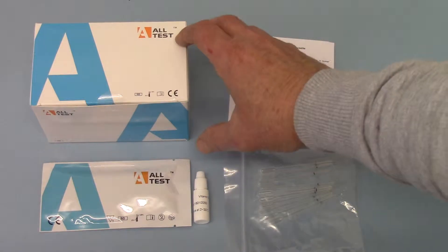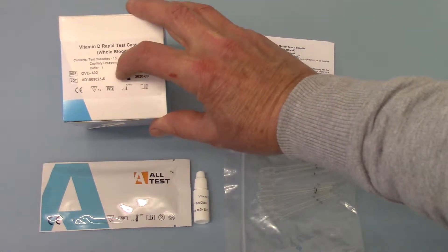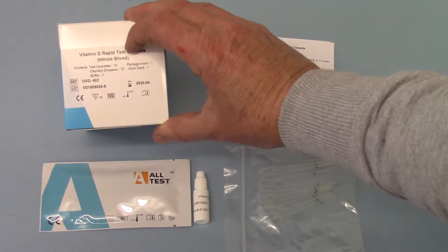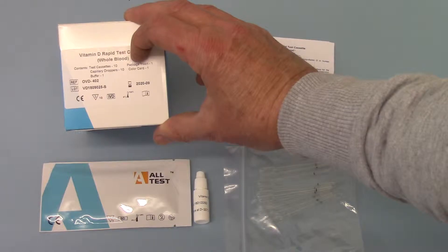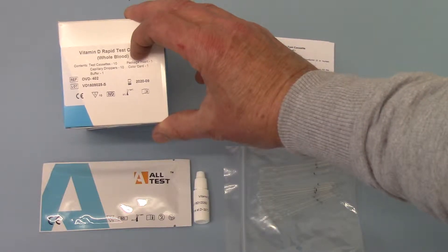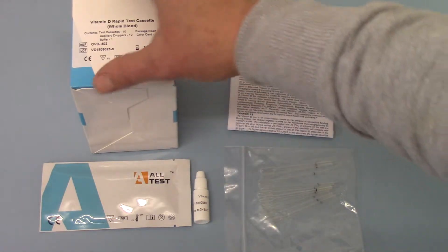The pack reference number is OVD402. These contain 10 test cassettes, 10 capillary droppers, a pack insert, a colour card for the interpretation of your results, and a buffer solution.